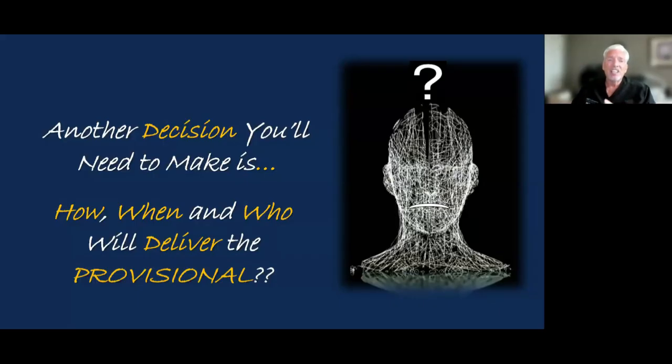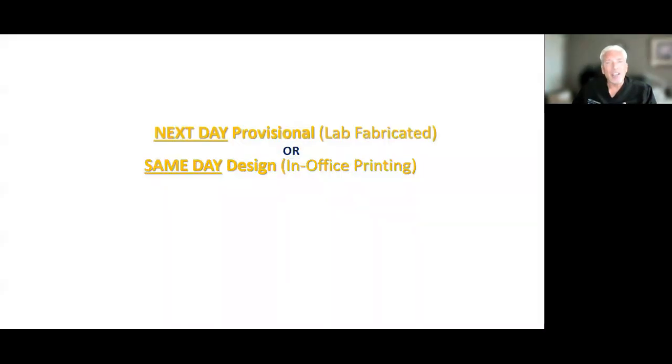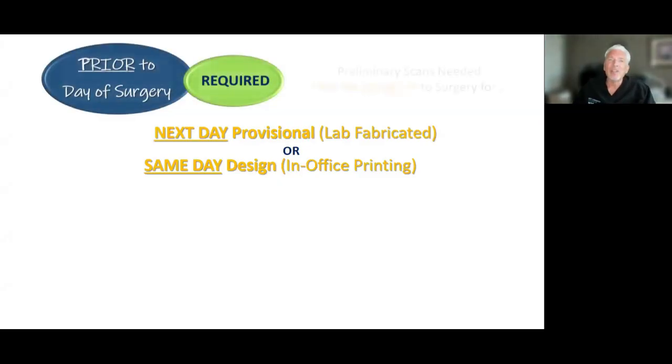But you're going to see that this gives you an opportunity where you don't have to do anything prosthetically that day, quite frankly, more than put a multi-unit abutment on. And I'm going to show you all that. To me, that's the exciting part of this: it gives us more options. And yes, it's more to think about. But once you find one that works for you, I think you're really going to be able to embrace this more confidently and competently to provide your patients with this treatment modality that so many of them want and deserve to have.